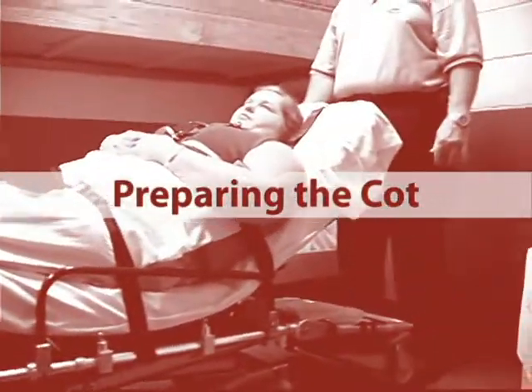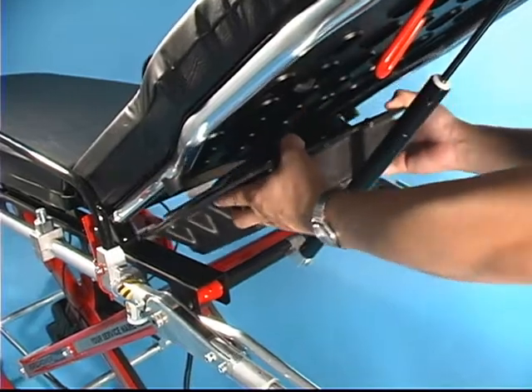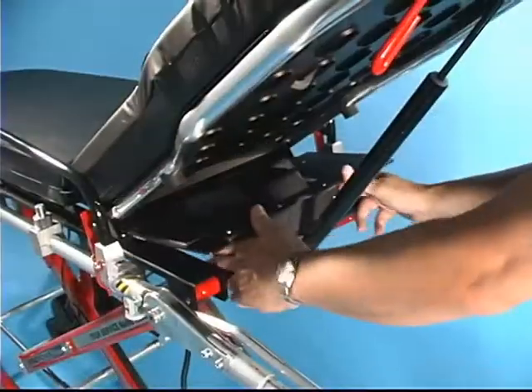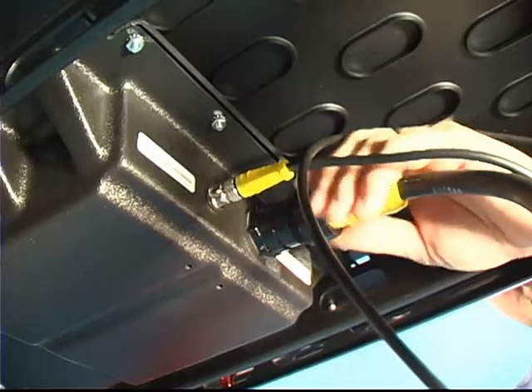Preparing the cot. Before placing the PowerFlex in service, you must connect the power pack and attach the mattress and restraints. To connect the power pack, connect and screw in the control unit connector and the actuator unit connector cables to the power pack.